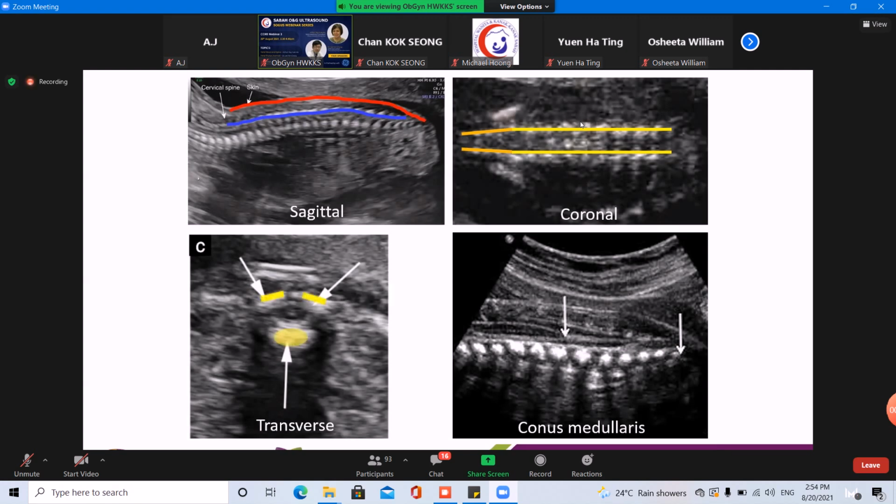The vertebra is made up of the vertebral body in front and the neural arch at the back. And you can see that the lamina and the transverse process are in the form of a Chinese character 8. In between is the spinal canal, and you can see the spinal cord here, and the white thing is this spinal cord.